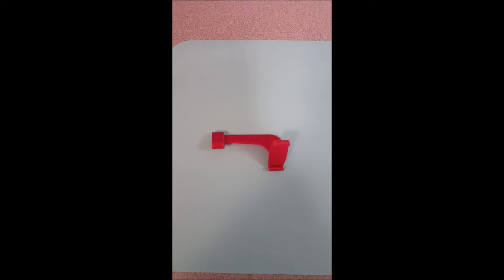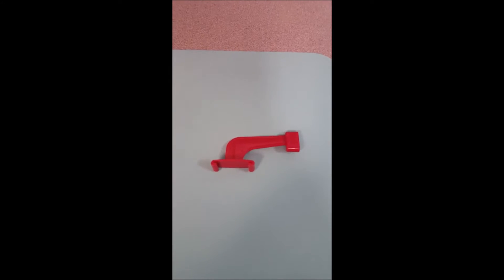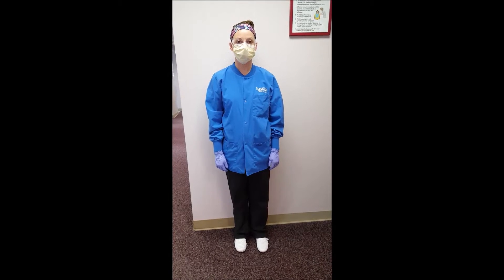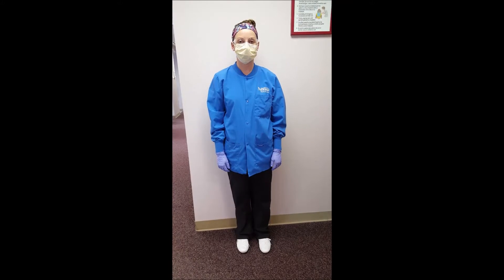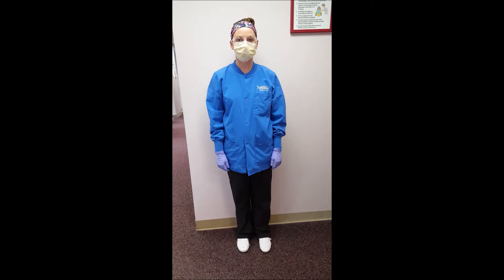There are two types of bite wings: horizontal and vertical. You will need to be wearing proper personal protective equipment — leather shoes, scrubs, clinic jacket, gloves, mask, and glasses.